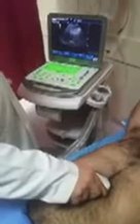The second image I take in the first examination is the subxiphoid window of the pericardium. For seeing the heart from the subxiphoid view, you have to put your probe first under the right costal margin, and you see the liver here.